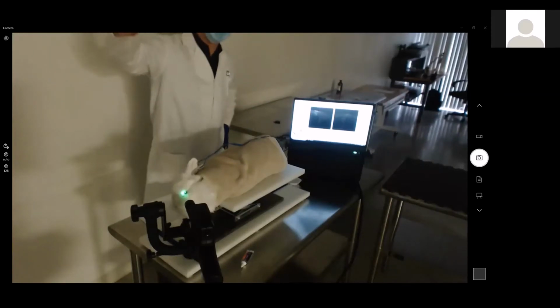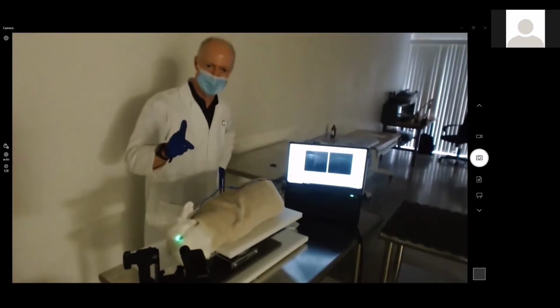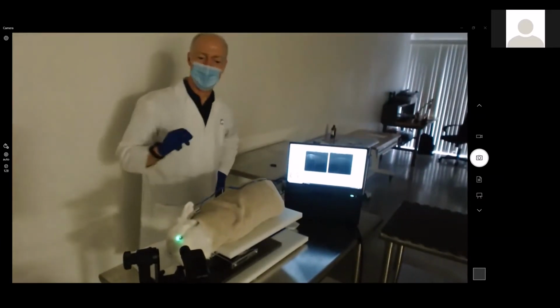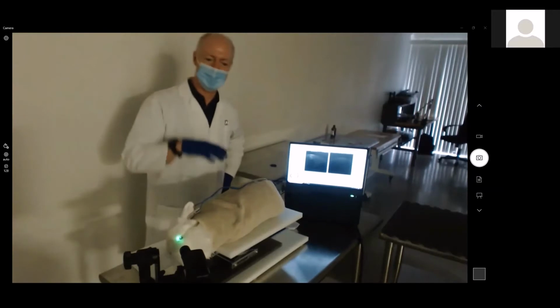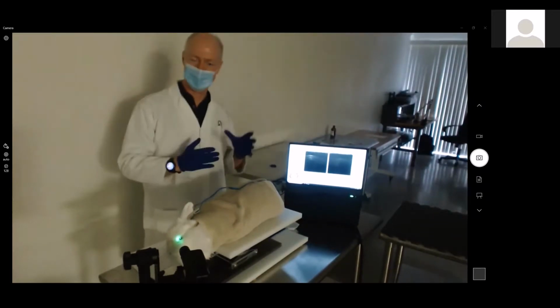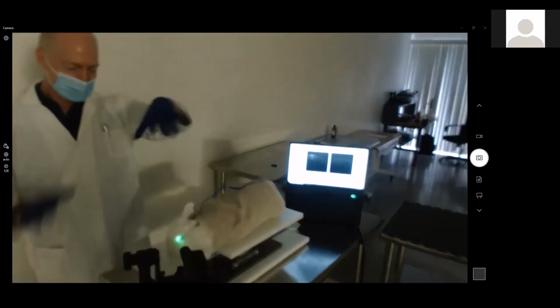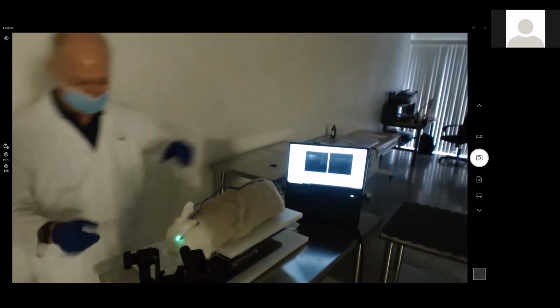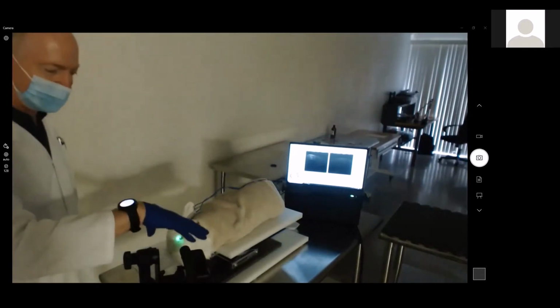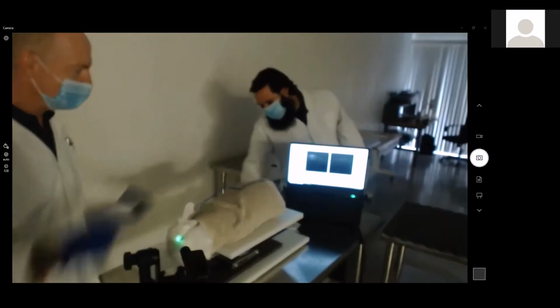Okay, folks, back. We're at wet lab number 3. Okay, sorry about that little delay. We wound up turning off lights and wanted to make sure you could see things on the screen, so that took us a few minutes just to play with the lighting. But I think you should see now the rabbit up front here, and Lily is sitting sedated in front of our optics for our OCT.